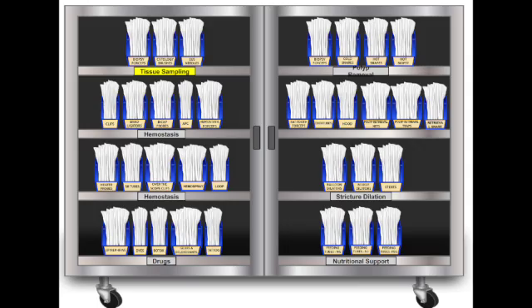Absolutely. And the retrieval hood. Sounds protective. It is a key safety device. It's a soft plastic hood fitted onto the end of the scope. You use it specifically for retrieving sharp foreign objects. Think pins, needles, razor blades, safety pins. Things you definitely don't want scraping the esophagus on the way out.